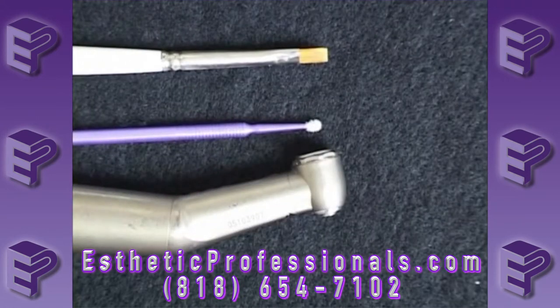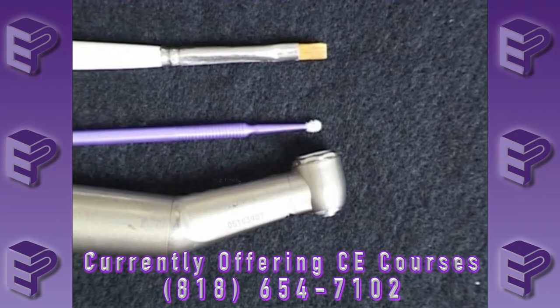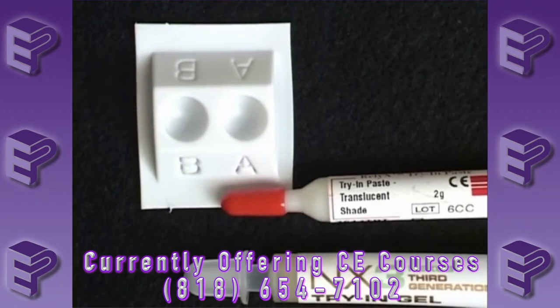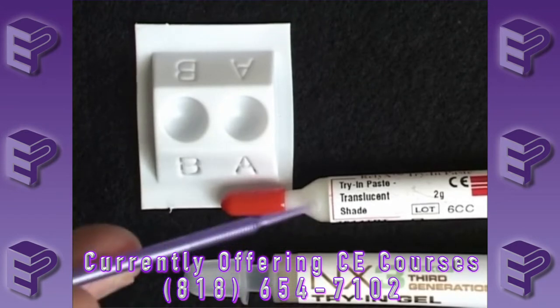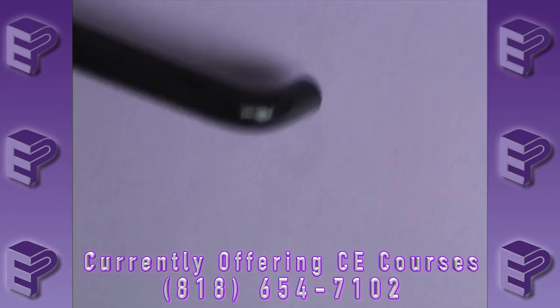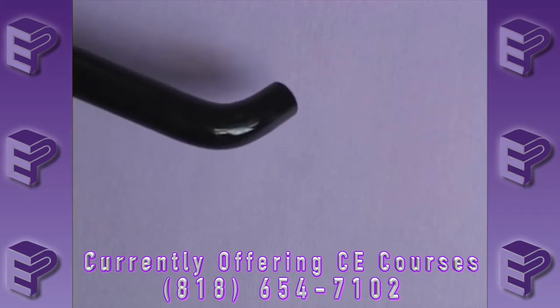For this exercise, we're also going to need a high-speed handpiece. We're going to need a wide composite placement brush — we get these from Cosmodent, it's a number 3 — and a microbrush for putting on the bonding agent. We're also going to need a mixing well for our bonding agent, and then some clear water-soluble try-in gel. This is just a couple of examples: one from Kerr and one from 3M. These are water-soluble try-in gels for veneers — they won't set. We're also going to need a curing light to cure our resin tints and opakers.